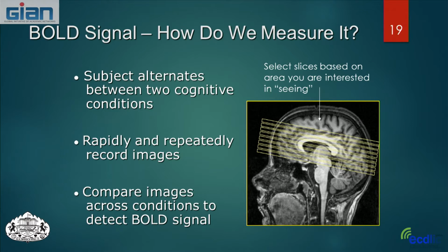So they'll oftentimes skip a slice. That's to allow the original slice to get back to baseline as far as the relaxation in the longitudinal and the transverse planes before they collect the data in the slice next to that. Does that make sense?